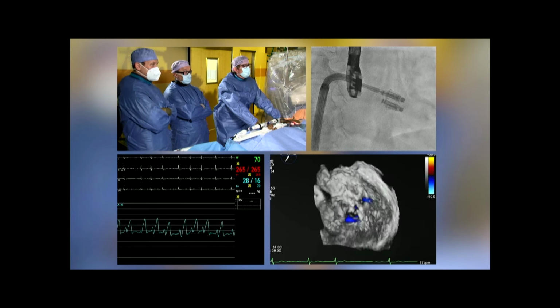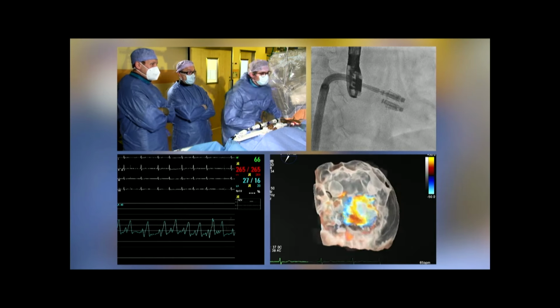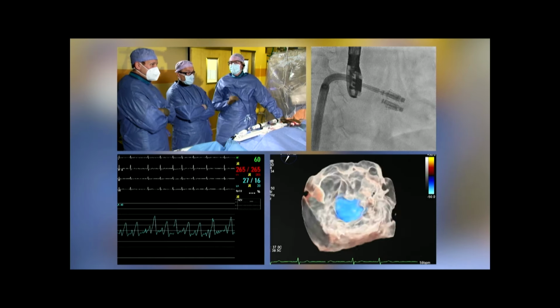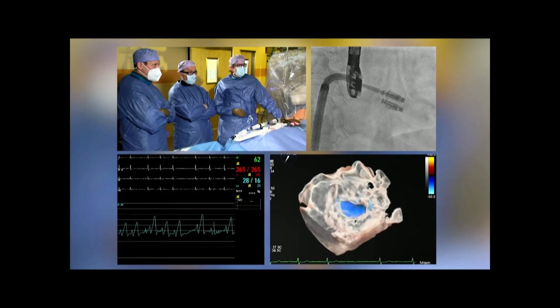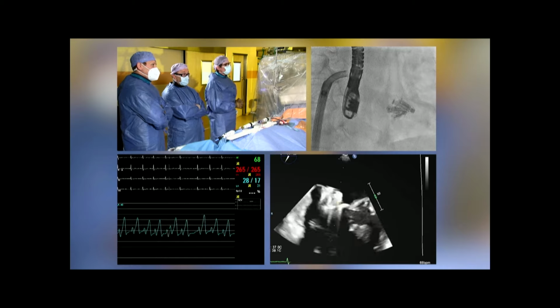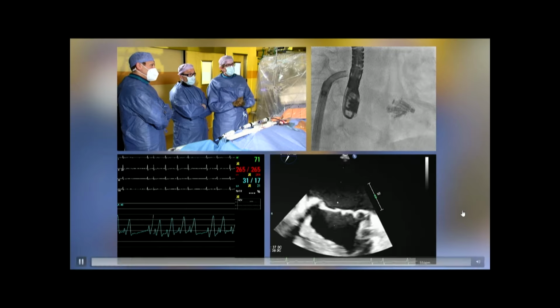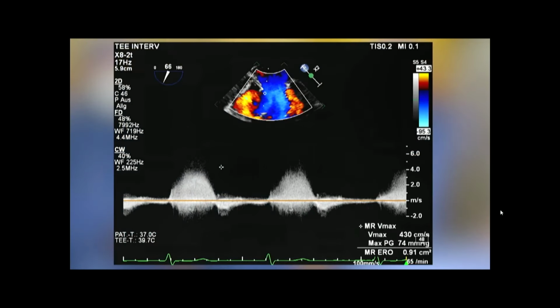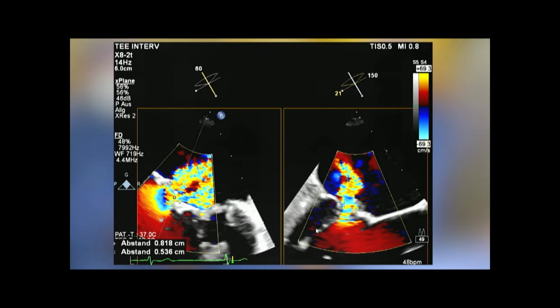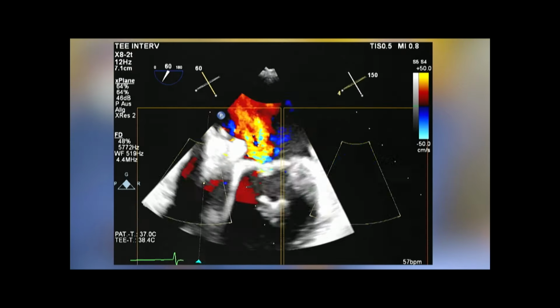We have tremendous improvement in pulmonary vein flow. We have a tremendous improvement in left atrial pressures. Mean LA pressure came down by 10 millimeters of mercury. V wave came down 30 millimeters of mercury. Can we have the preview again, please? The initial baseline MR, just to remind ourselves of what we started off with here. So this is the measurement of 0.9, and here we see the vena contracta in biplane. So a huge MR, and that is actually what it is right now.